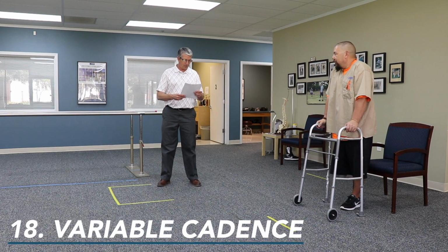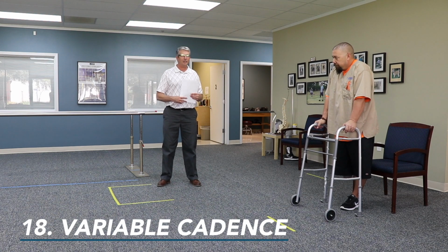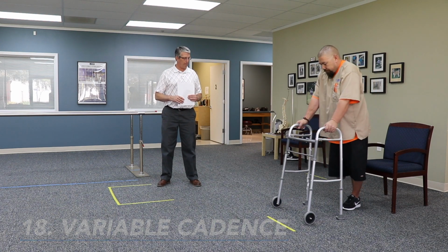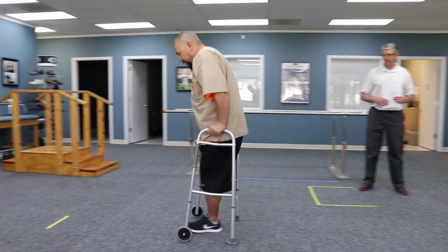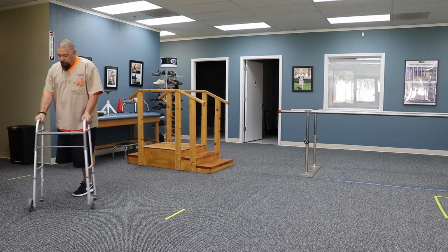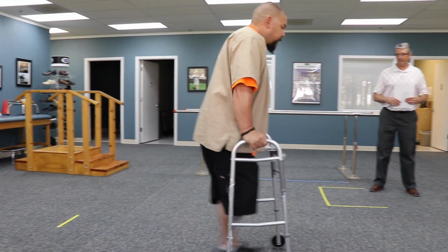Number 18, variable cadence. So Jay's going to demonstrate his ability to adjust his speed. So go ahead, Jay. Go faster. Slow it down. Bring it back. Speed up. Slow down.